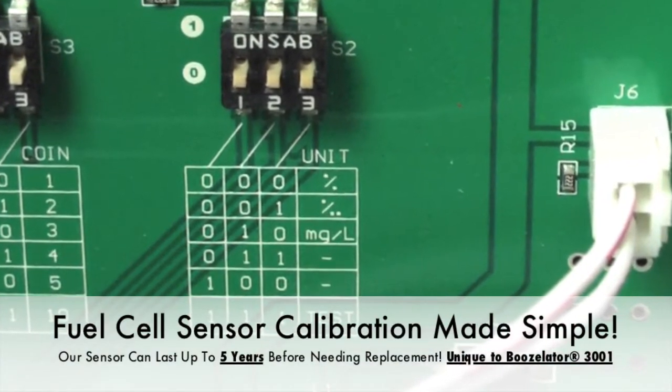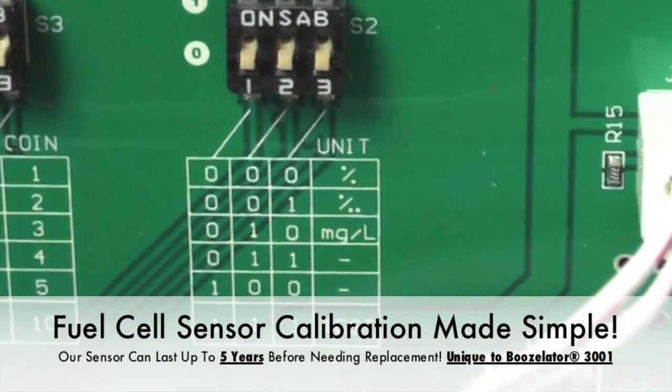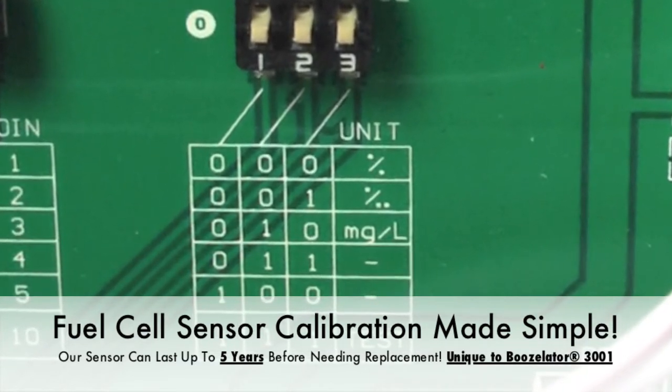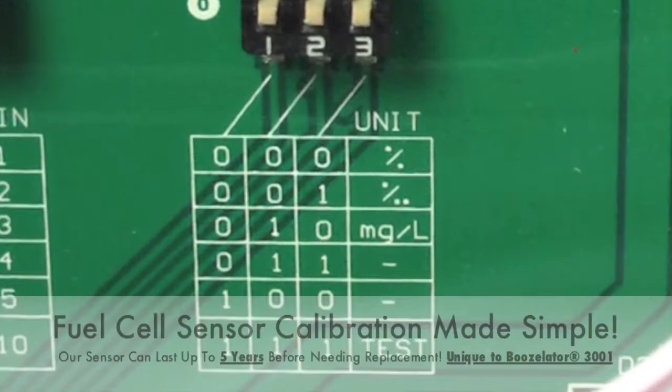In other countries, it may be BAC percent, grams per milliliter, or grams per liter. These are also the switches for calibrating your Boozellator 3001 machine. There are no knobs to turn. Simply flip all three of these switches to the up position and the Boozellator is ready for calibration by either wet bath or dry gas.